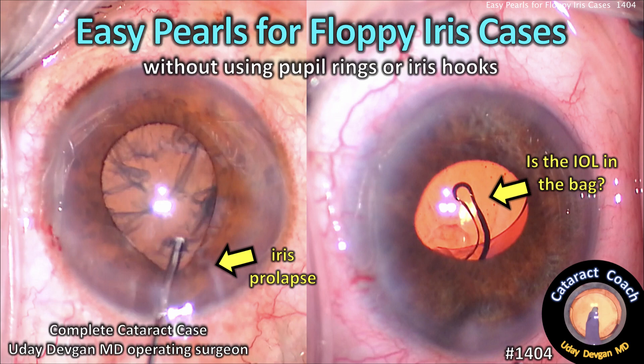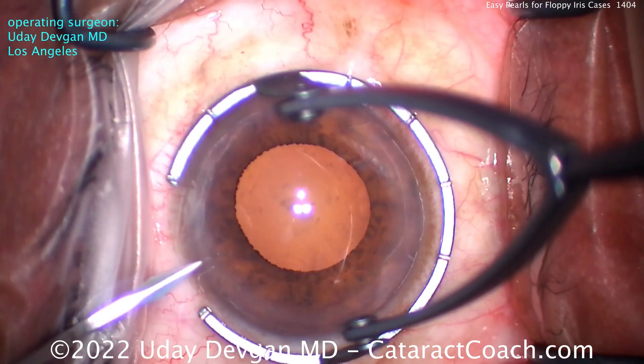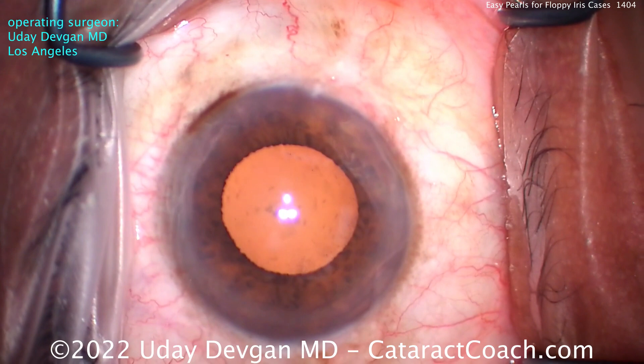CataractCoach.com — easy pearls for floppy iris cases without using a pupil ring or iris hooks. Let me show you a full case start to finish. Here's a patient with some floppy iris syndrome coming up — a Flomax user, otherwise a pretty routine cataract.